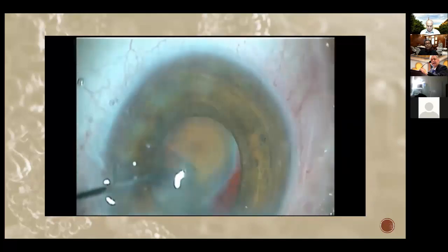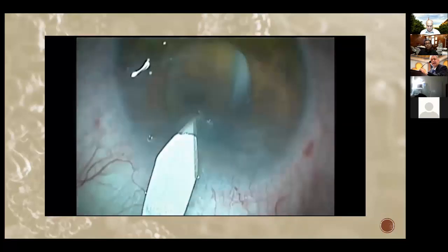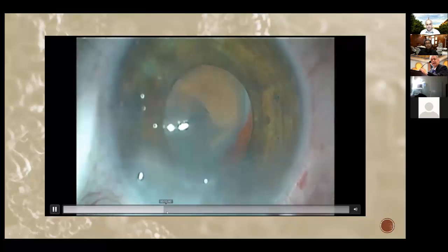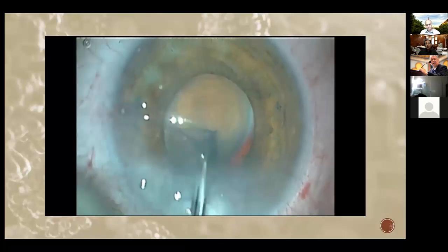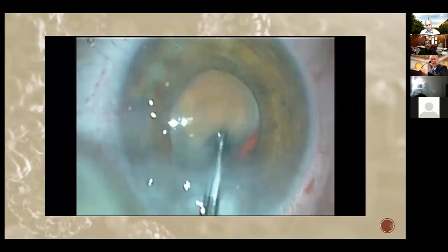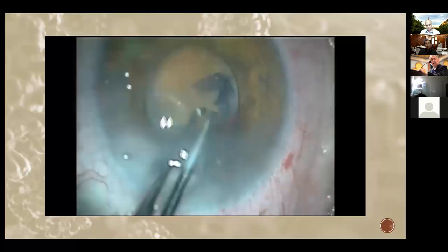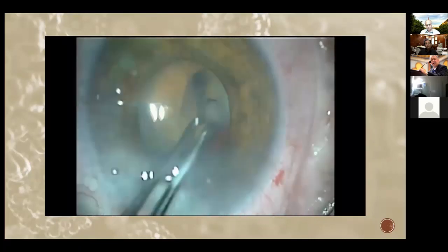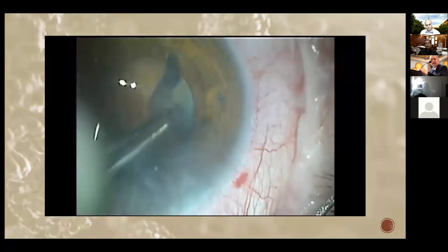So now I will go for rhexis forceps from the main tunnel, create the main wound, and I start using my rhexis forceps from the main tunnel. I still use the shearing method. My flap is constantly moving in the direction where my rhexis is going to be. I put the flap on the anterior capsule all the time.